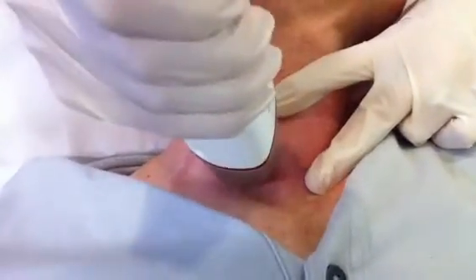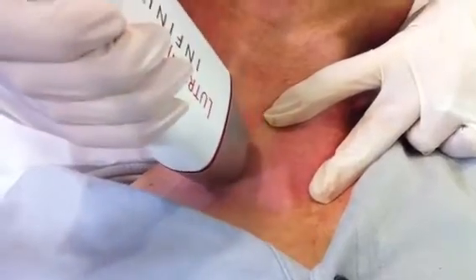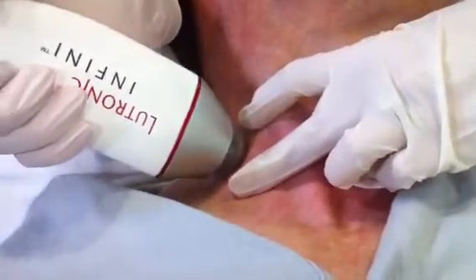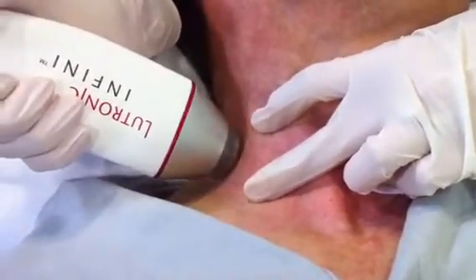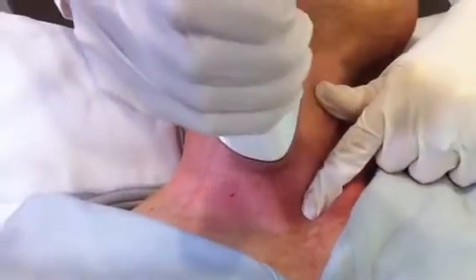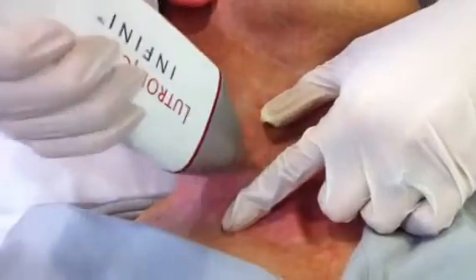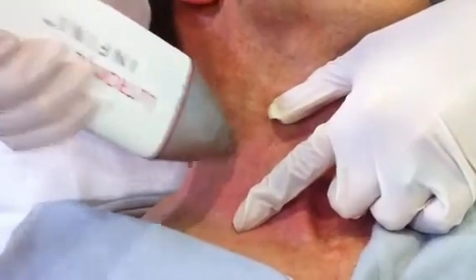And once the needles are deposited, this radiofrequency energy is delivered, and this causes a thermocoagulation zone, which is basically an area of heating delivered to the collagen that stimulates more collagen growth and skin tightening and tissue remodeling over the subsequent weeks to months. This is usually done as a series of treatments. I usually space treatments out about 4 weeks between each treatment period.